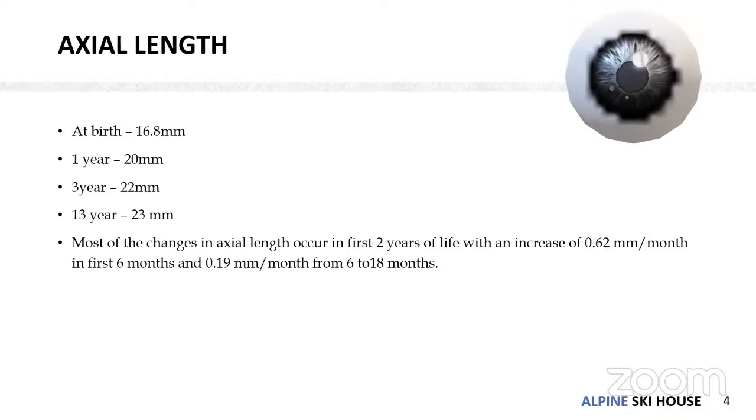The main issue is that if we use the undercorrection formula for unilateral cataract, there is quite large anisometropia. If the patient has, say, +6 diopter anisometropia, the patient is going to have dense amblyopia. So in such cases, we do not do the complete undercorrection. We just do a little bit of undercorrection, and we expect that the patient will be more myopic later. But that we can correct by various methods, like putting a sulcus correction IOL later or doing a corneal refractive procedure. So in unilateral cataract, generally we do very little undercorrection.